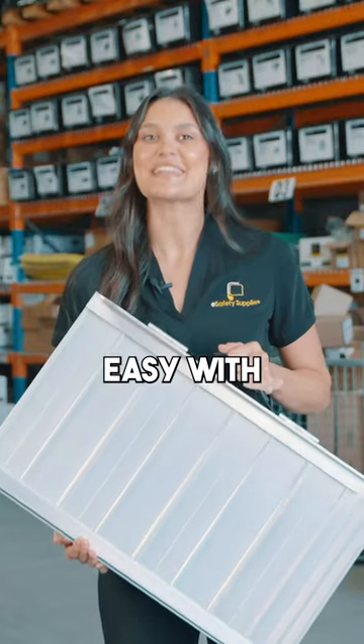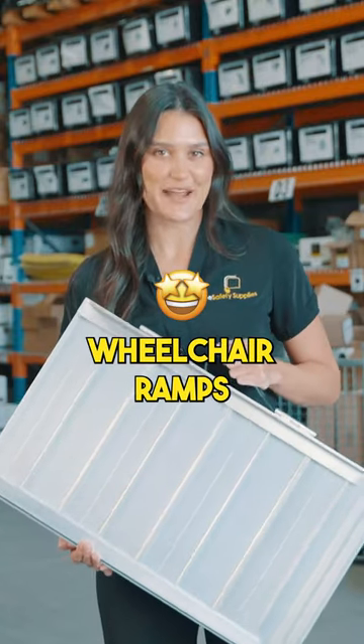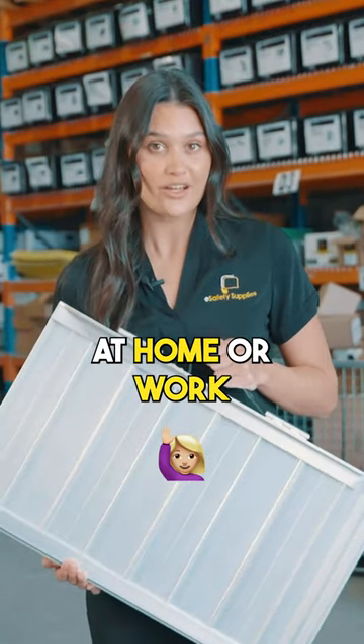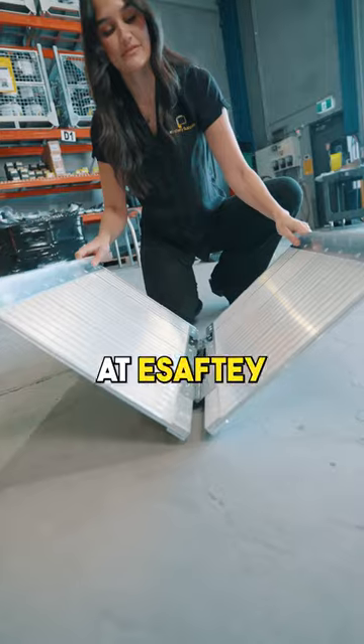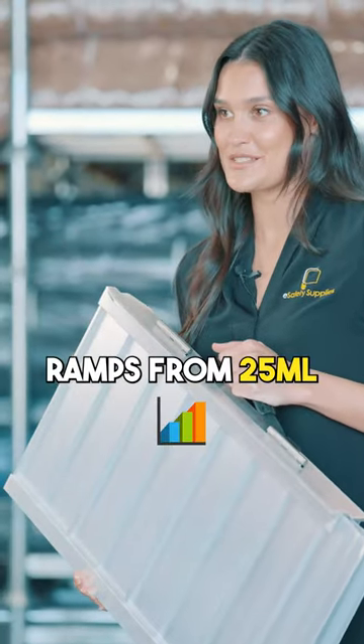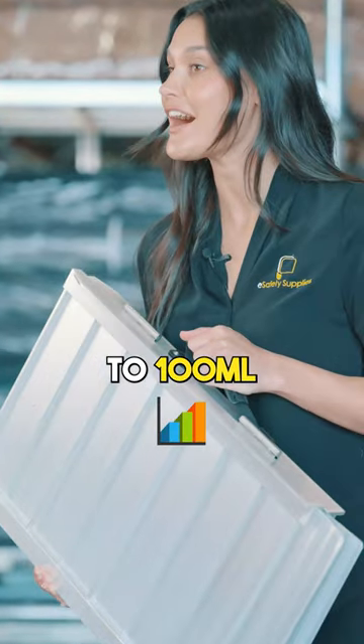Access made easy with eSafety Supply's wheelchair ramps. Looking for hassle-free access at home or work? Look no further. At eSafety, we offer seven sizes of wheelchair ramps, from 25 mil to 100 mil.